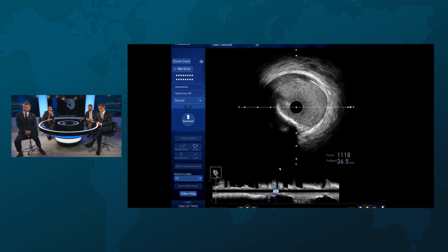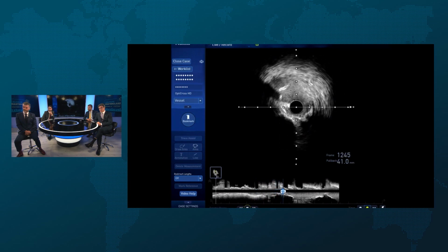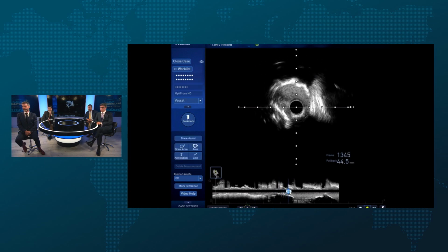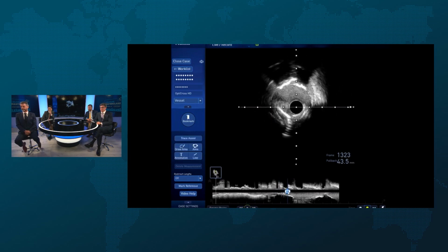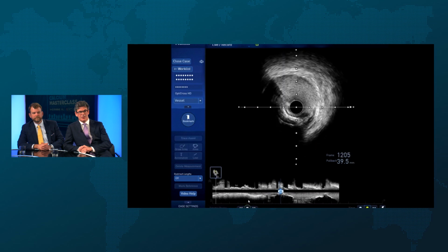So you have the fractured nodules. I think you've definitely, I mean, there's a change from the pre. There's no question. Massive, lovely change. Look at that. That's where the concentric stuff was, and you see a beautiful kind of movement of the broken plates here as we come through.